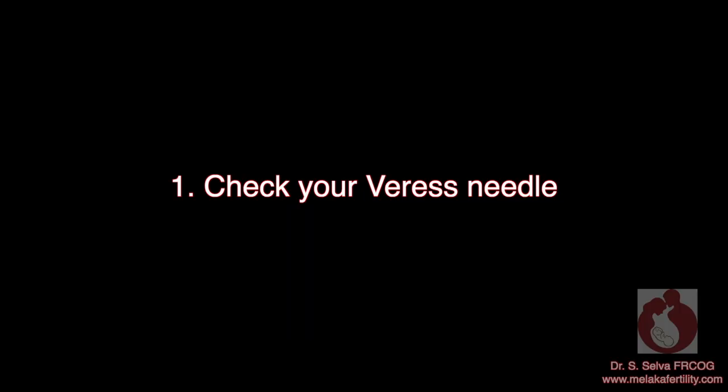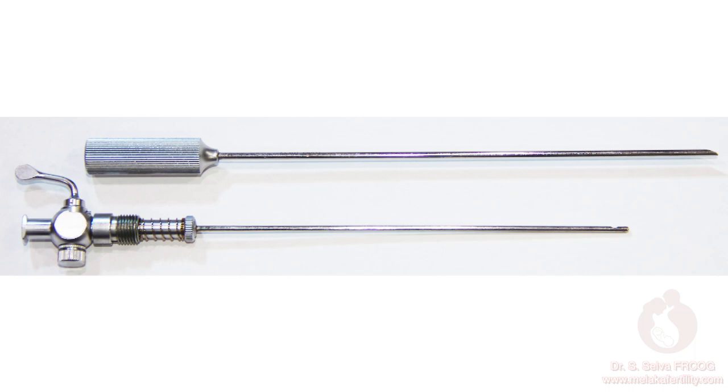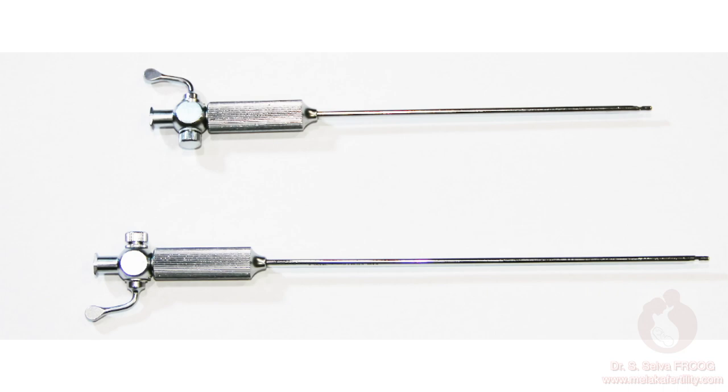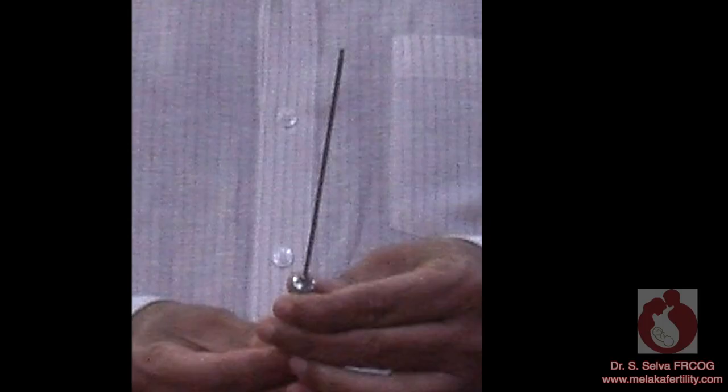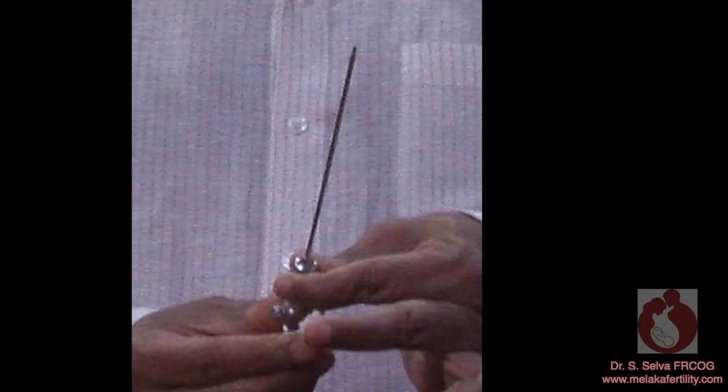Check your Veress needle. This is an important step. The Veress needle is made up of two parts: the outer sleeve and the spring-loaded inner sheath. Veress needles are of different lengths. Make sure you personally check that the insert and the sleeve match. Sometimes the outer sleeve is assembled with the wrong length of inner sleeve. It is very dangerous when the inner sheath is shorter than the outer sleeve, as the tip is not protected. Also make sure that the spring on the inner sheath works well before starting the surgery.